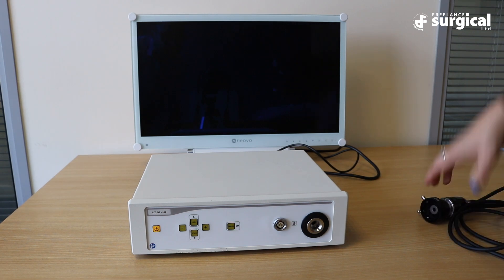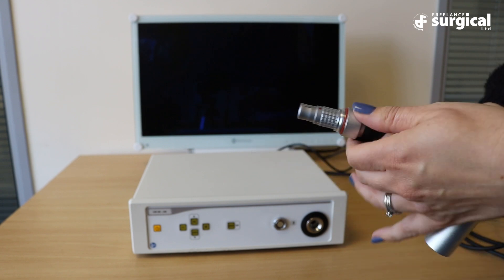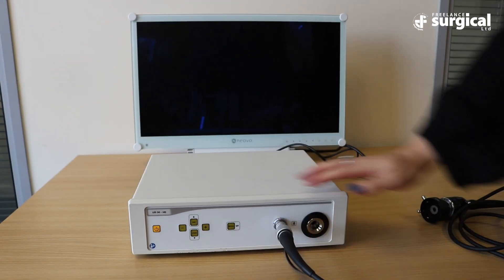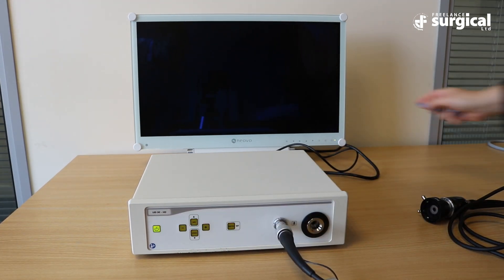You now need to plug in the camera. The red dot on the connector needs to be facing upwards when plugging in. Now turn on the unit and monitor and wait for the unit to run through its setup procedure.